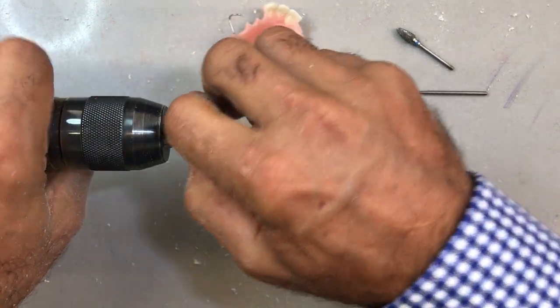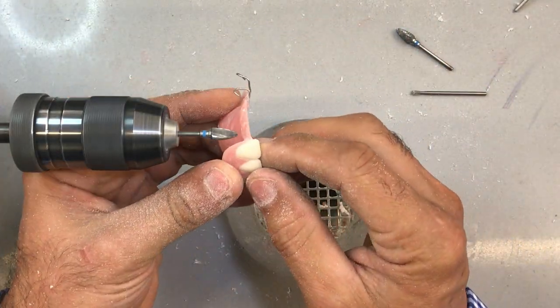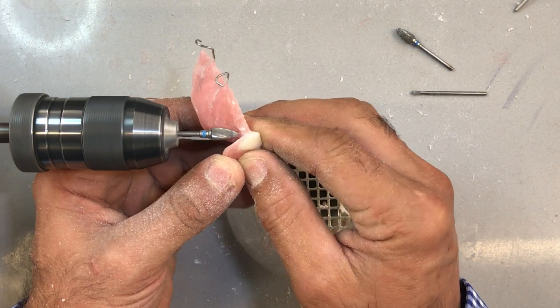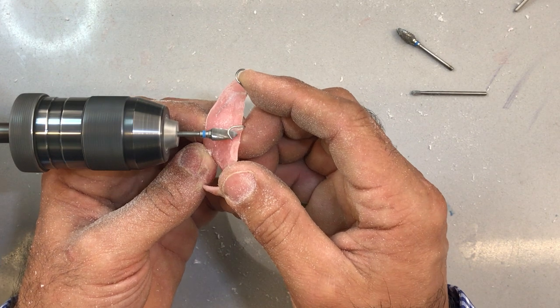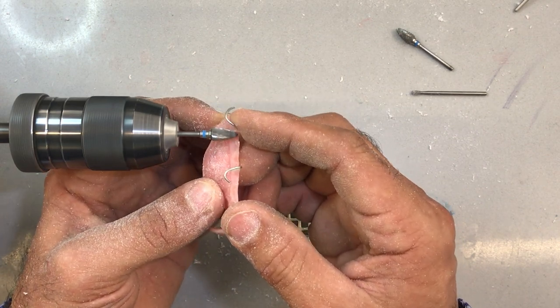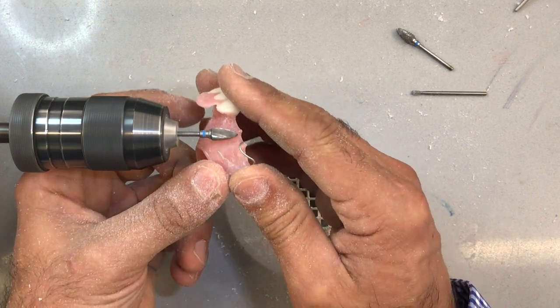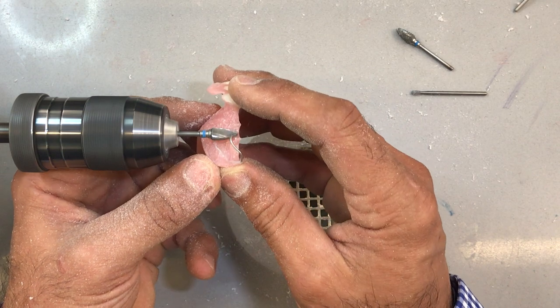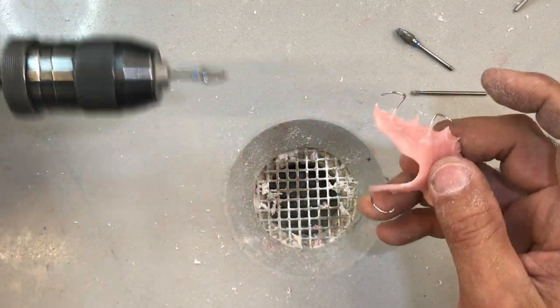The elimination of undercuts that you saw me do with the handpiece — you can certainly do them on the lathe. There's no right or wrong; it's whatever you feel comfortable with. The lathe is probably my favorite way of doing it because I can get a better sense of parallelism when eliminating undercuts on the lathe versus the handpiece. I think I'm close, so I'm going to try this on my duplicate model and see how it fits.